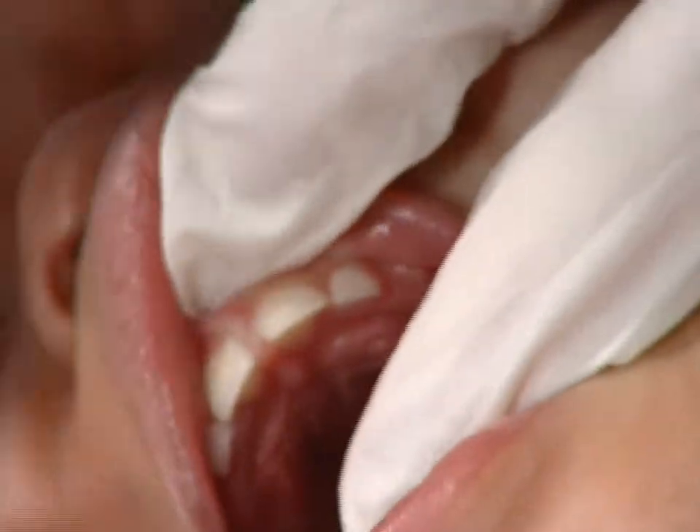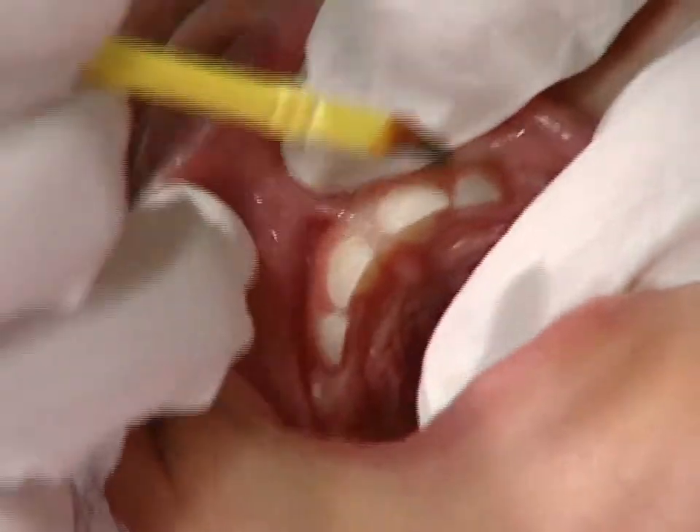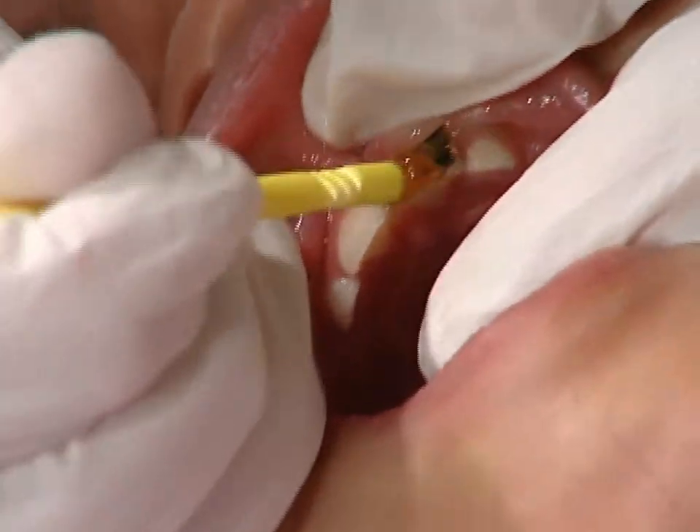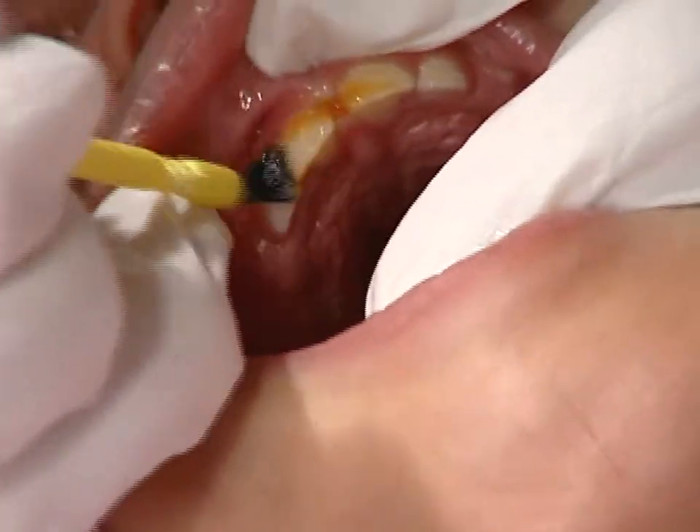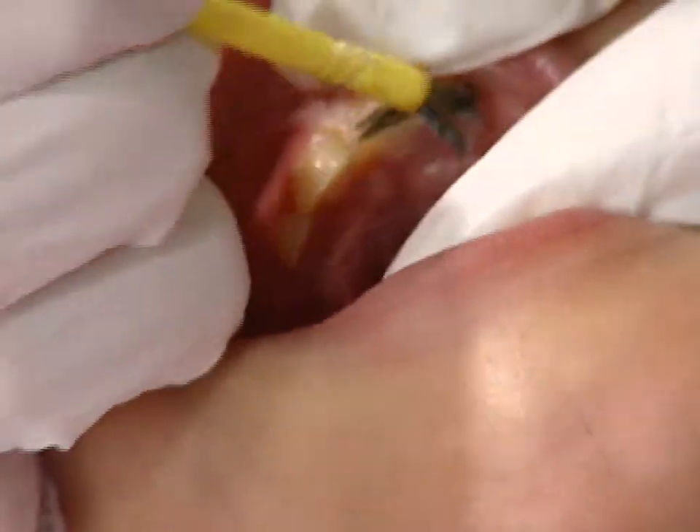Julia has no back teeth yet, so we will only need to apply the varnish to her front teeth. Dry the upper front teeth with gauze and paint on the varnish, covering all the teeth. Try to keep the tongue out of the way with your fingers.